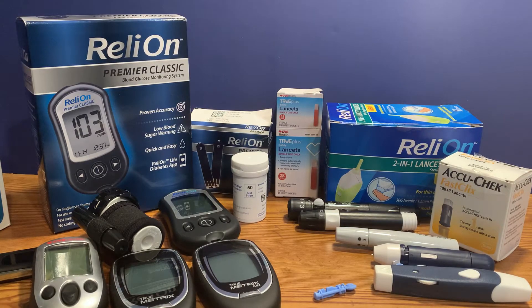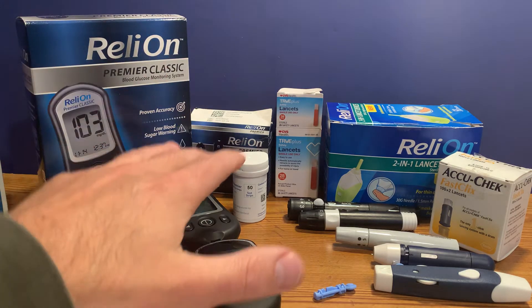Hi, this is Josh, pharmacist with PharmacistTips.com, here to show you how to test your blood sugar at home and how simple it is to perform this test at home or on the go. You need three things.